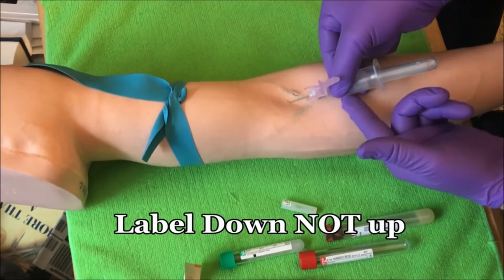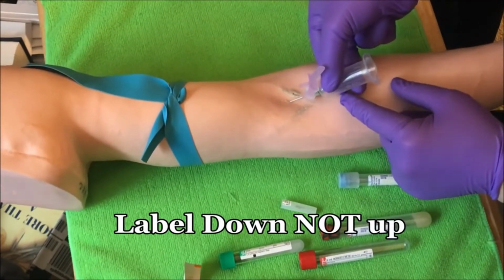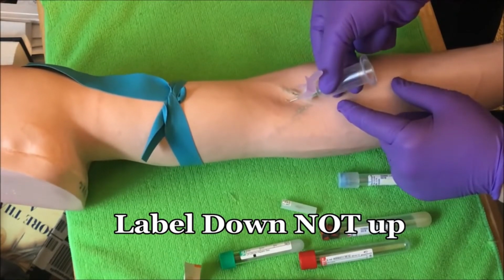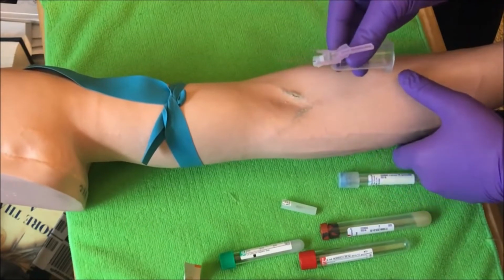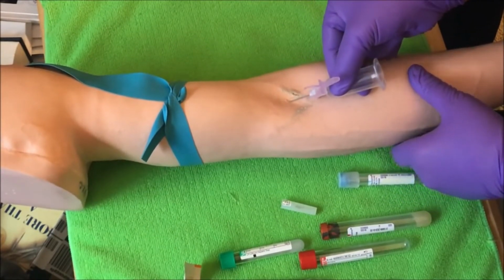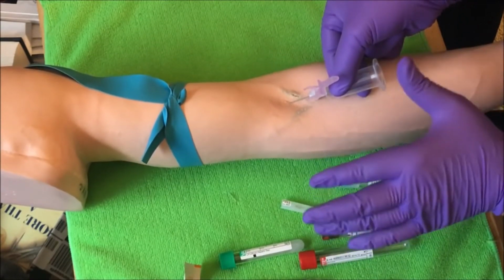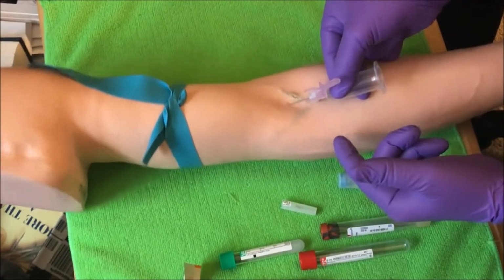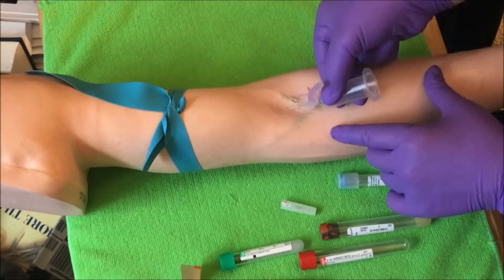And if you see, my 2 fingers are resting. Let me explain this real quick. My 2 fingers are resting on the arm. It's not floating like this where my needle is moving. If the patient moves, it can mess up my needle. Once I go in, 2 fingers and a thumb, retract, push in, my 2 fingers rest on the forearm. I should have some pressure, not too much pressure, but enough where my arm will move with the patient. If he moves, my hand moves, and it doesn't just cause this type of effect.